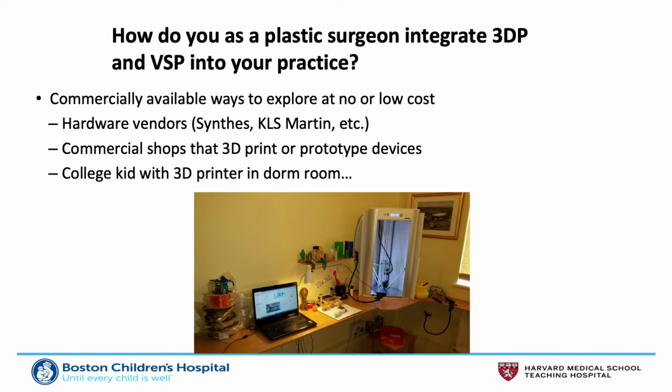So now you probably have some ideas about how you as a plastic surgeon can use VSP and 3D printing in your practice, but how do you actually start incorporating them? Well, there's a number of no or low cost ways to dip your toes into 3D printing. For example, if you do some bony work, you probably can already work with a hardware vendor in your area to make 3D models, to do some virtual surgical planning, to print cutting guides.